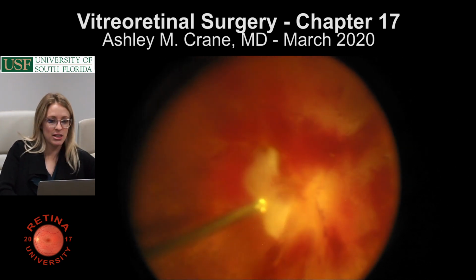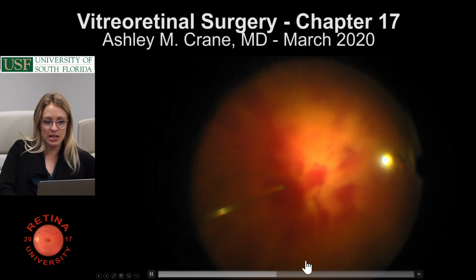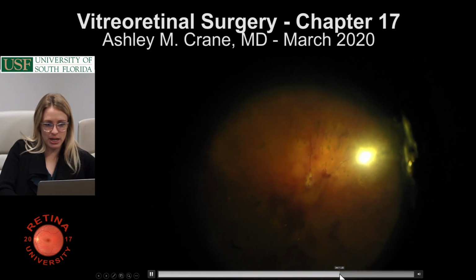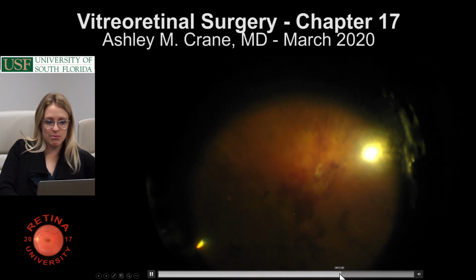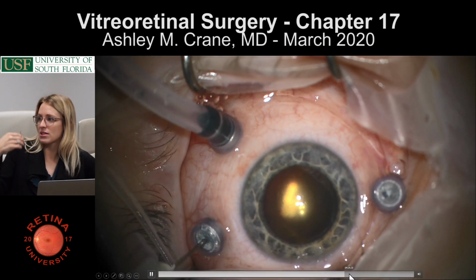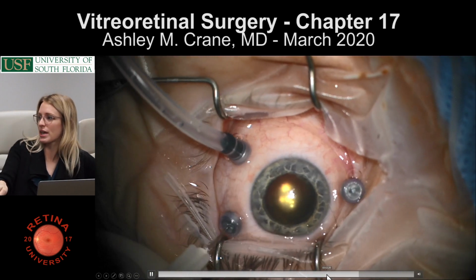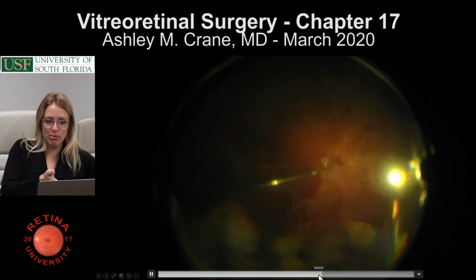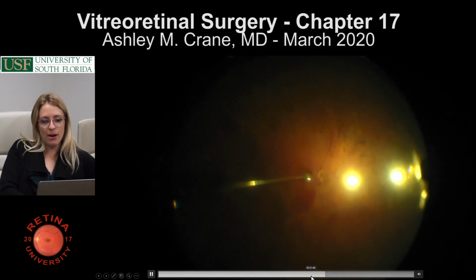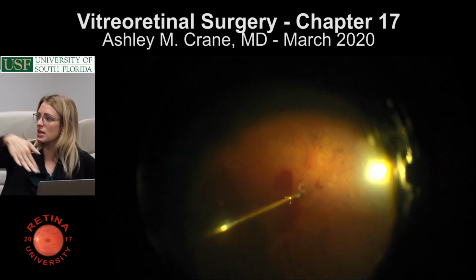That's what it is. So here's scleral depression at the end of the surgery, shaving the vitreous base, then removing some of the blood, and a tamponade is happening now. Basically this is an important part of surgery. Fluid, if you want to get air or gas or oil in the eye, you have to take the fluid out because you can't just push the gas in. So you have an instrument called a soft tip, or an extrusion cannula, that basically sucks the fluid out and air comes in the infusion line.